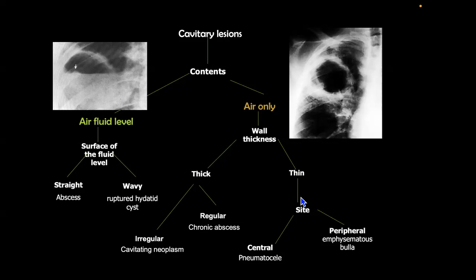Thank you, Dr., for this very important question. As we all know, investigations should be tailored to answer certain questions. Critically ill patients are just as the name implies, they are ill. They might have affection of the chest, concerning the brain, so you never know.